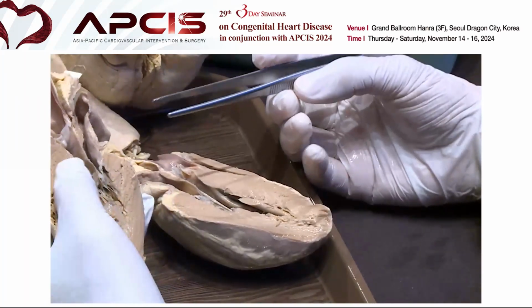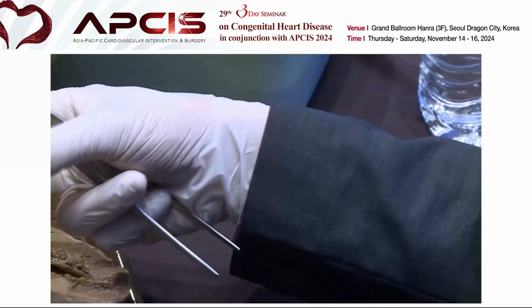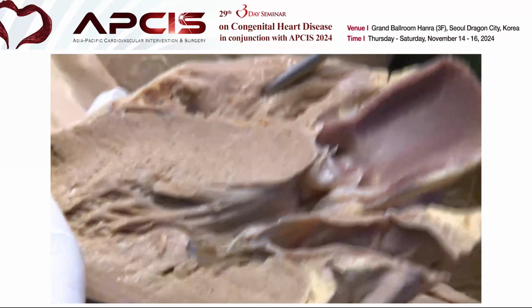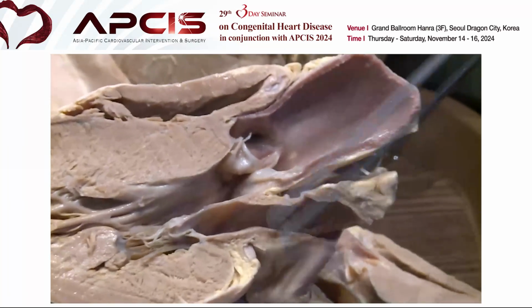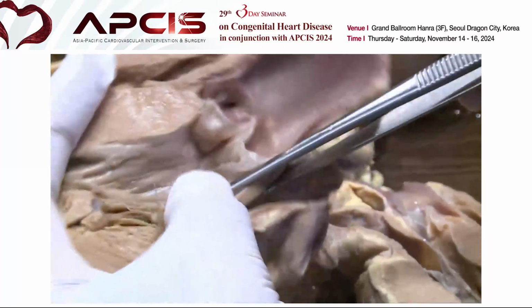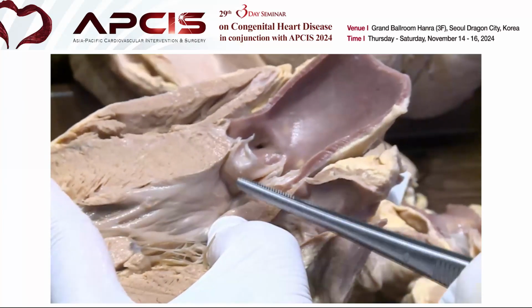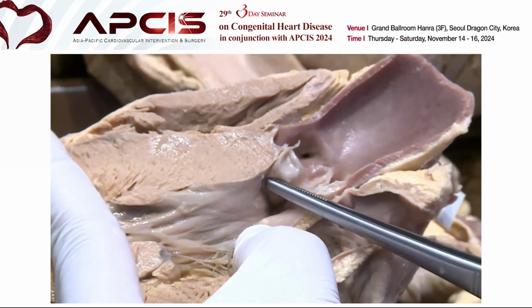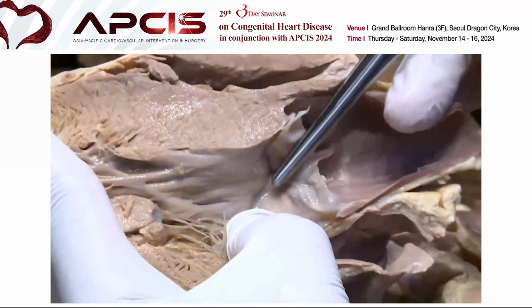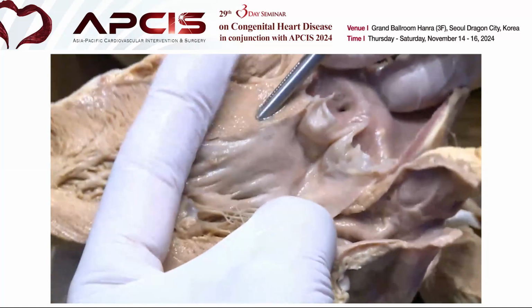So let me start by showing the structure of the aortic valve and annulus and supravalvular structures and so on. Now you can see the parasternal long axis view showing the right ventricle, ventricular septum, ascending aorta, left atrium, and mitral valve. And here you can see the aortic valve clearly. Dr. Jo-Ik-sung has described very precisely what the aortic valve annulus is. Annulus means the lowest border of the leaflet. So this point is the lowest border of the right coronary cusp, and this is the lowest border of the non-coronary cusp, and the left coronary cusp is on this side. So there is an annular plane, meaning this area.